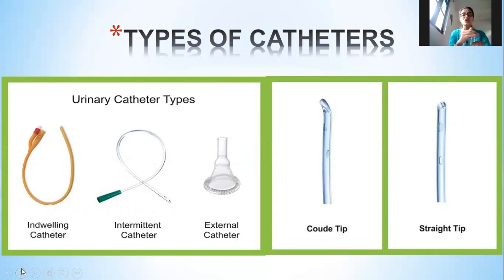You need to do long-term catheterization, and so that the patient's family could afford it, these silicone catheters are there. Rubber catheters, you can use for about 28 days.